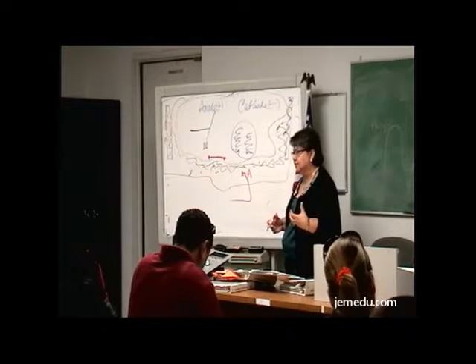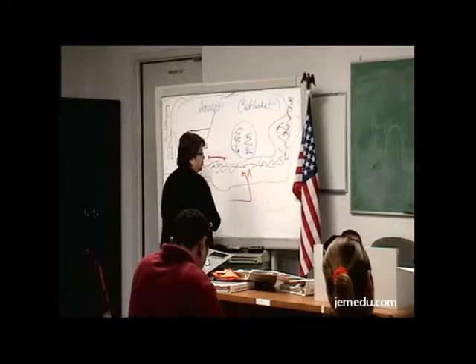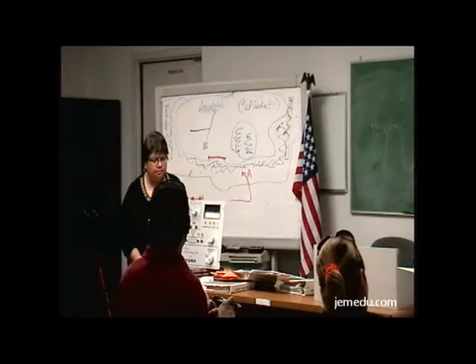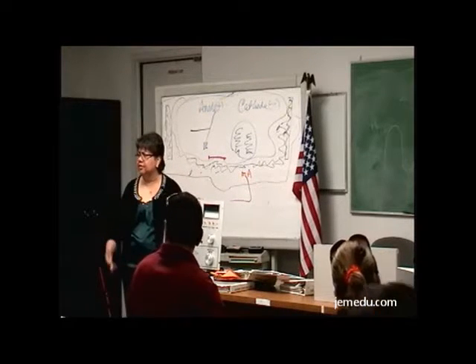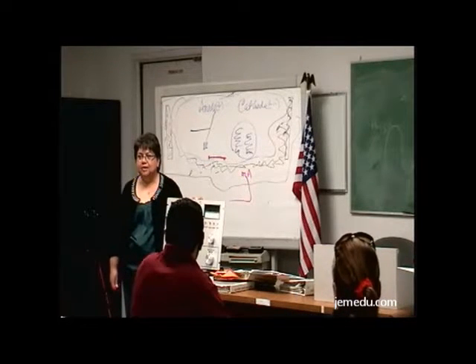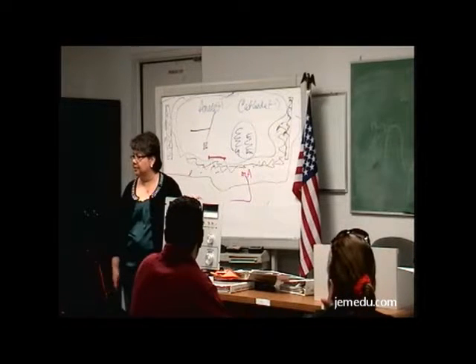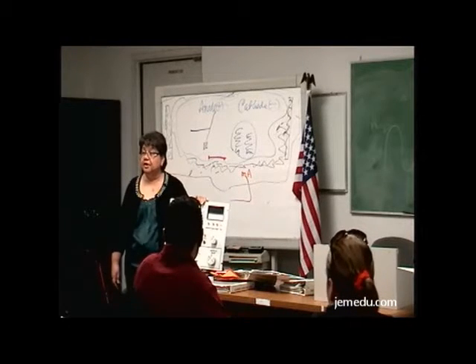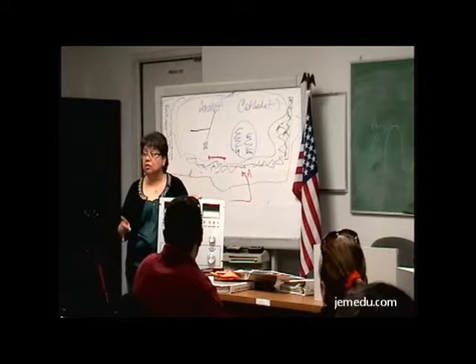So we talked about the three things we need. So now let's put them in order of how this is going to work. So we select our milliamperage. Why do we select a milliamperage? I said it's because it's our source of electrons, but why one station versus another selector? We have a whole bunch. Can I just use the 400 for this one, or the 200 or 100? Producing the heat, no? This is basically going to select our milliamperage, but also it's going to select our filament, if we're going to go to the small or the large filament.